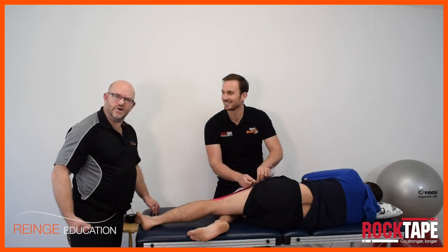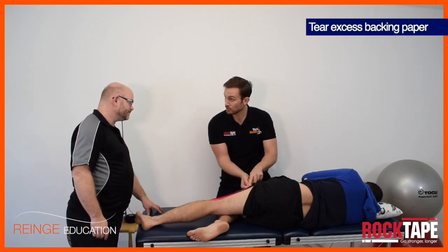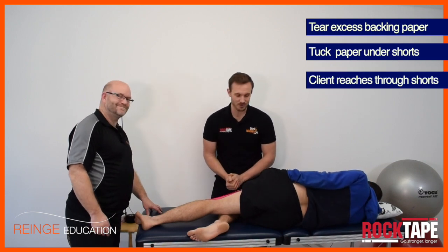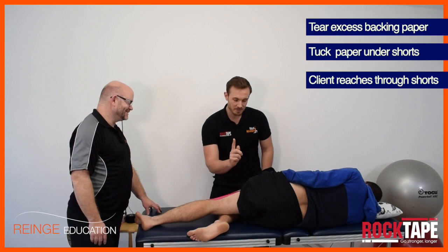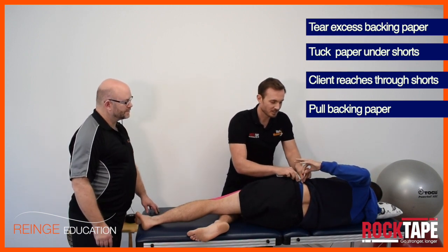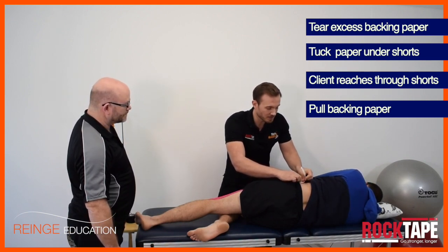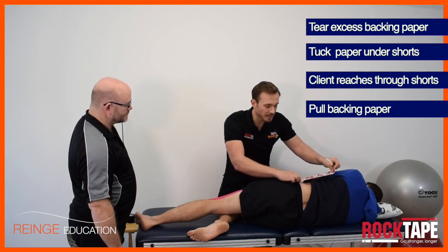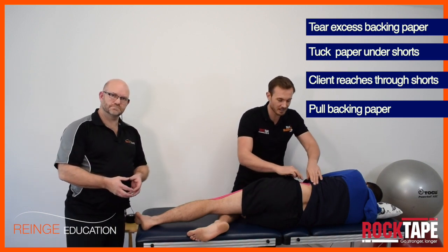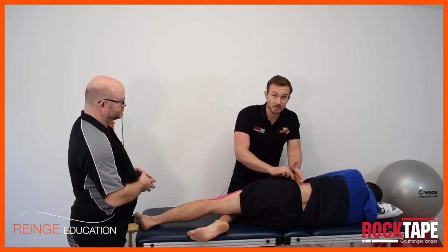This looks like where a problem is going to start — how on earth do we do this? First, tear away any excess backing paper but make sure you've still got some backing paper to tuck underneath their shorts. Then ask your patient to reach down through their shorts and importantly through their underwear — otherwise they'll stick their underwear to themselves — grab the backing paper, and pull it in line with the existing tape. Once the backing paper comes out the top, take it from them, pull the backing paper, and it will pull the tape through with it. The tape arrives out the top of their shorts, stuck down onto the lateral leg. If you've got excess tape, you can just cut it, but you want enough tape to come out the top of the shorts so you know it's been stuck down properly.